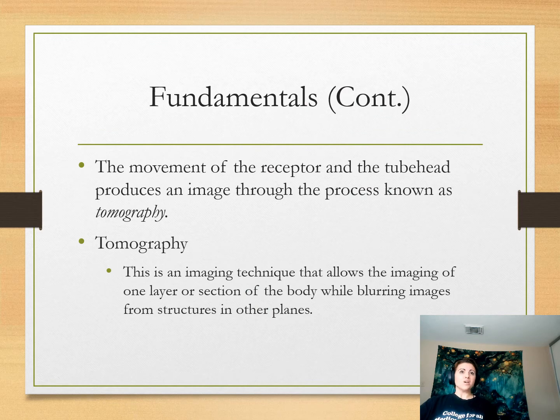Okay, so the basic concept of the receptor and the tube head moving around the patient is called tomography. And tomography is something we see in other types of imaging as well. It's not something that we use in intraoral. Intraoral is a single image, and it's taken one time at one point in the angle. It's always just one tiny pinpoint of time in x-ray images, right?